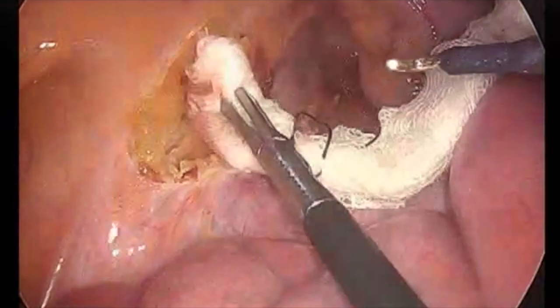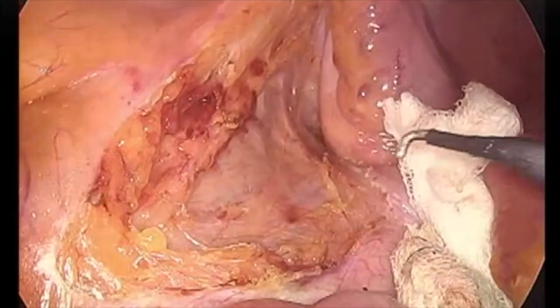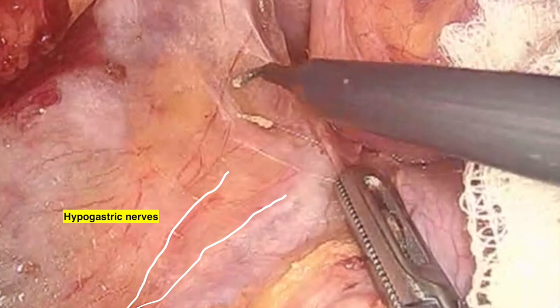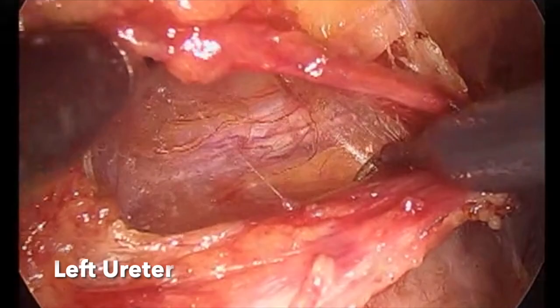We should maintain the plane between the presacral fascia and the rectum. We should not dig deep into the presacral fascia, as the chances of injury to the hypogastric nerves as well as the vessels will be more if you dig deep. Those are the inferohypogastric nerves, which are preserved, and the fascia over the nerves is intact. The plane between the rectum and the presacral fascia is continued inferiorly into the pelvis.